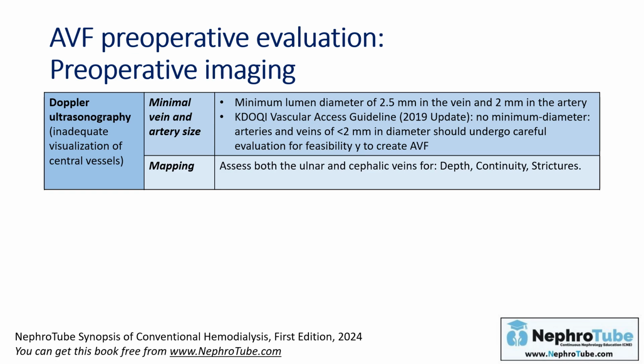The main limitation of the Doppler is that Doppler is inadequate for visualization of central veins. That's why we can use other procedures of imaging if you want to visualize central veins. And here comes the role of venography. Venography is used if there is a suspicion of central venous stenosis or any other central vein procedure, such as pacemaker placement, to assess central veins.